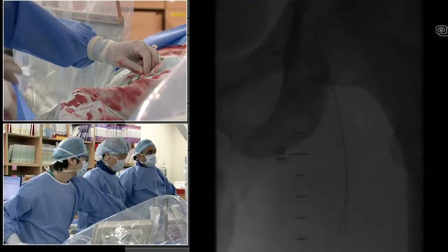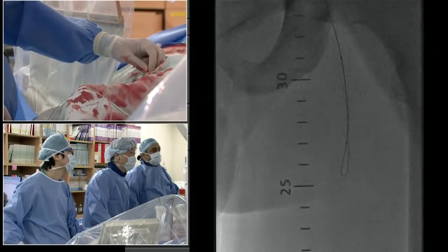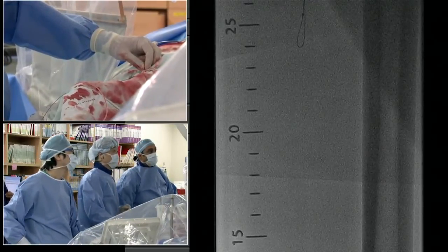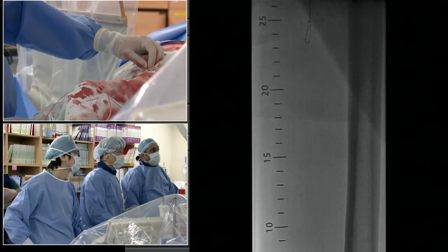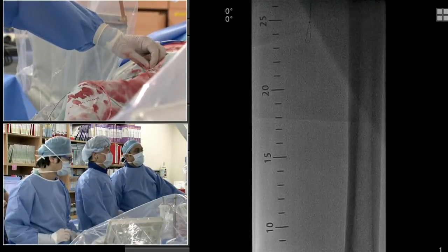So, taking that to straight AP. It's nice that you're utilizing changing the angle and so forth, and you don't have to go super fast. You're going the correct speed. And Ravish, it looks like you're so far doing well. Your loop's not too large.